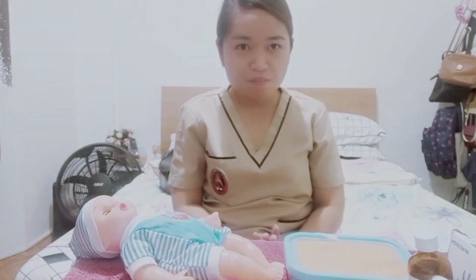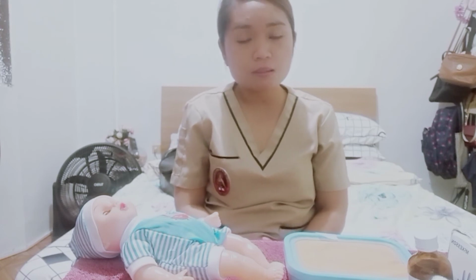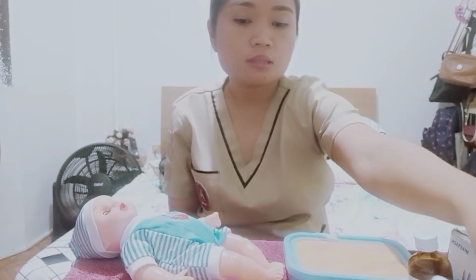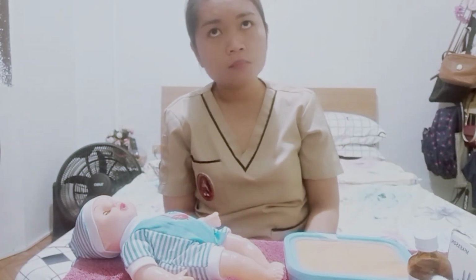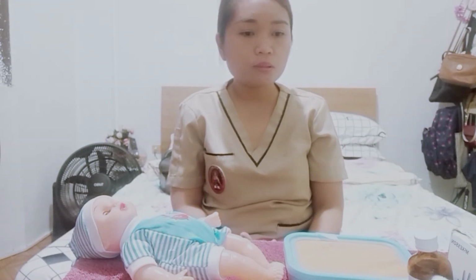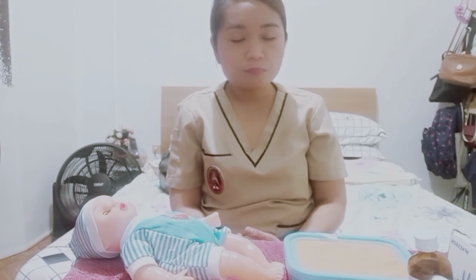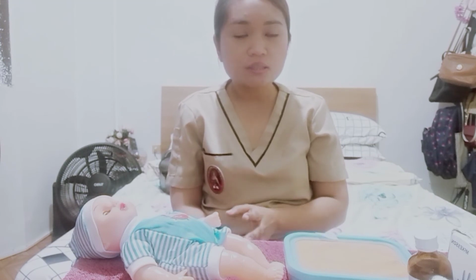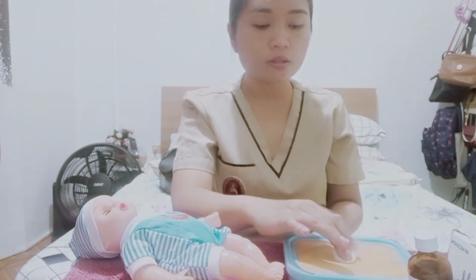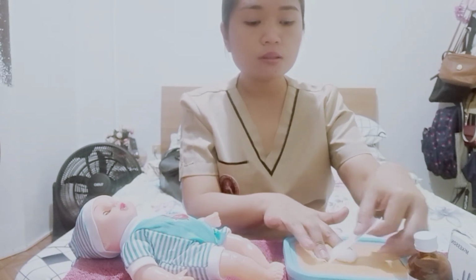Now, for post-vaccination, of course, we are going to dispose of all of our sharps, clinical and sharp waste into the waste bin, including any vials that we've used, and any plastic squishable cup that we used for our medication. And then after we've injected, we make sure that we secure the injected part with an adhesive tape. So say for example, this is the part that I've injected earlier on. After pressing it to make sure that the bleeding will stop, we then secure it with an adhesive tape.